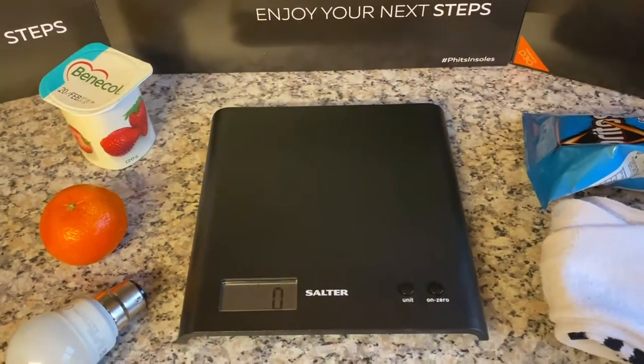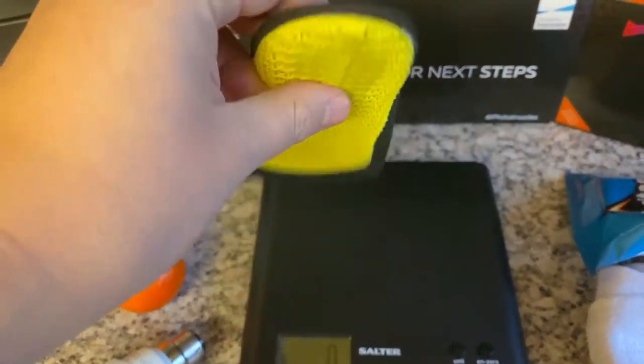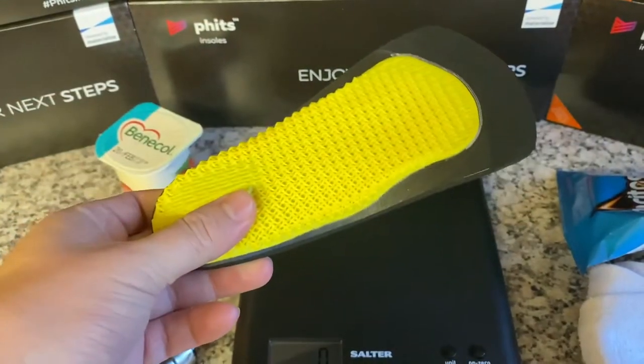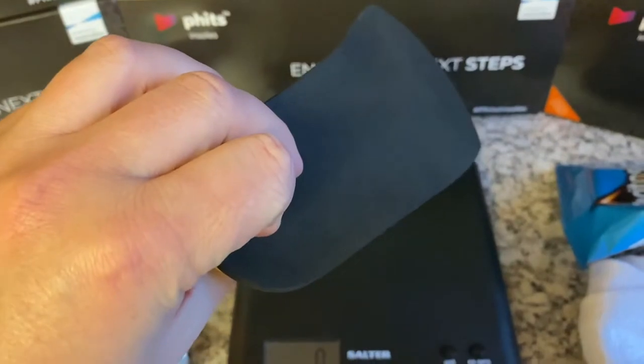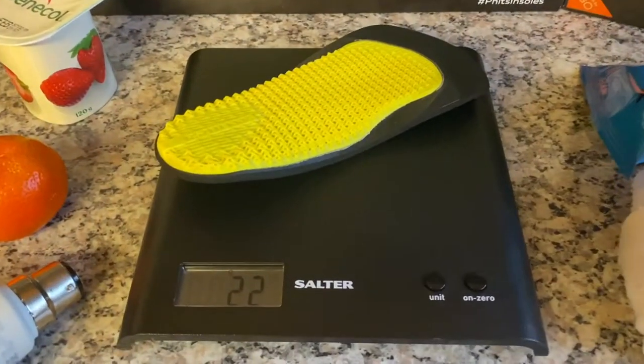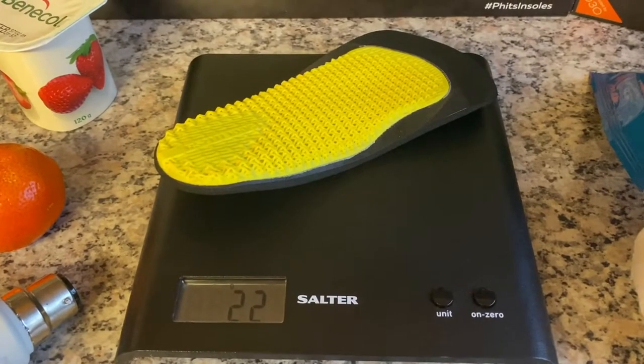Now for the FITS insole. Here we have our new low heel cut design, combined with a narrow shell, low lateral edge, metatarsal dome, and a three-quarter length top cover for comfort. 22g — that's just 0.8 ounces.